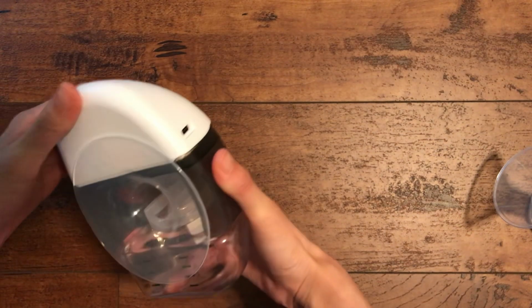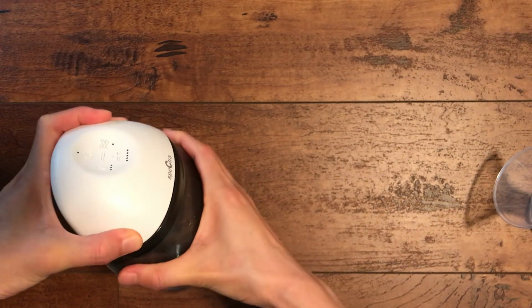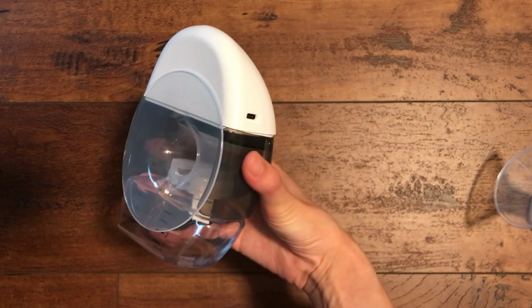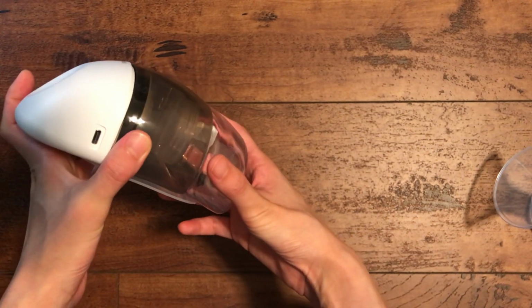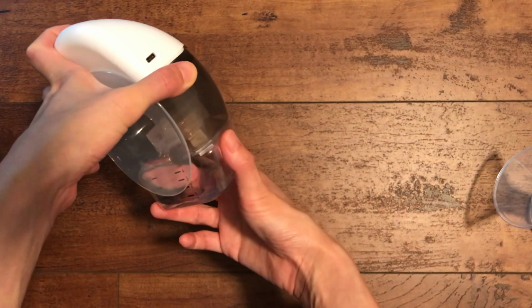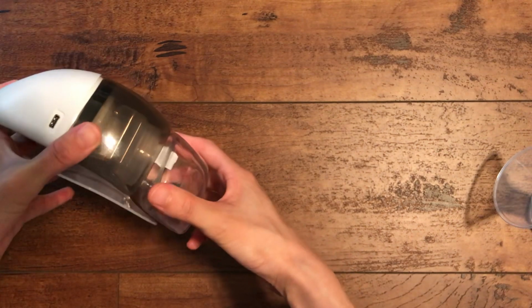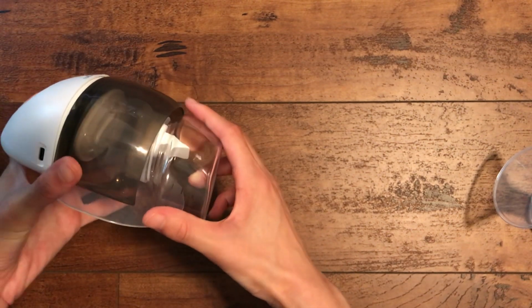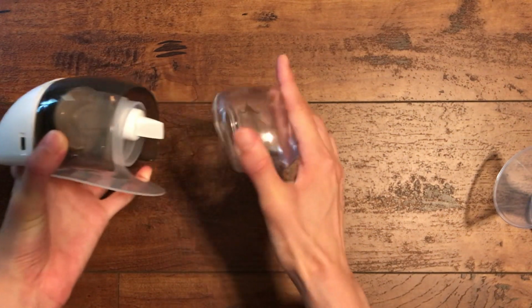So, all right, after the pumping session is done, obviously that was only one side. So I disassemble it. And initially I made the mistake of taking out the bottle first. I was so excited. I was like, oh, I produced like 3 ounces. I'm going to go ahead and store it. So I took out the bottle. Oops. Okay, that wasn't secure. That wasn't supposed to happen. That does not happen, I just didn't secure it enough earlier. Anyway, so I disassembled the bottle.